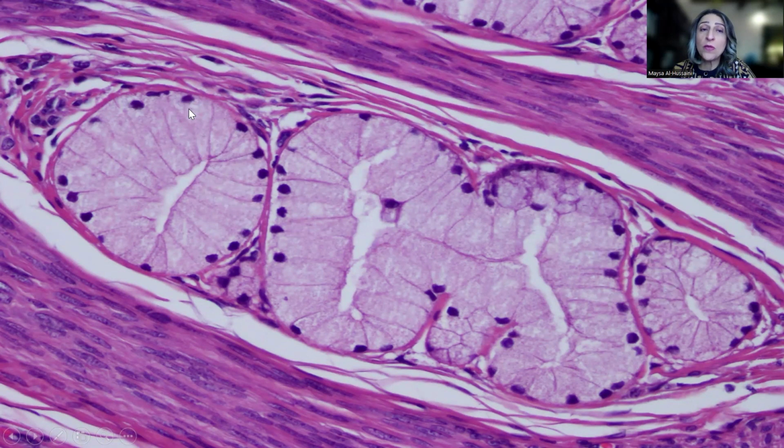But the most important thing is the large size of the cytoplasm. And in addition, we have in this particular case very small, minimally atypical nuclei that are basally located.